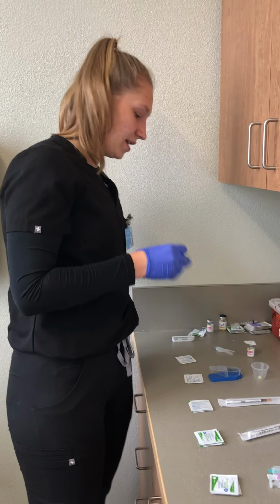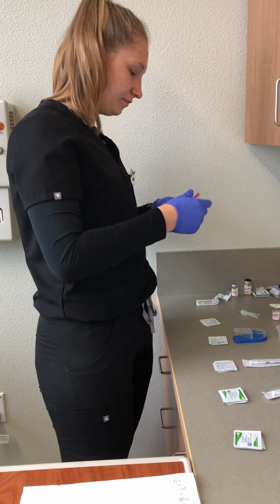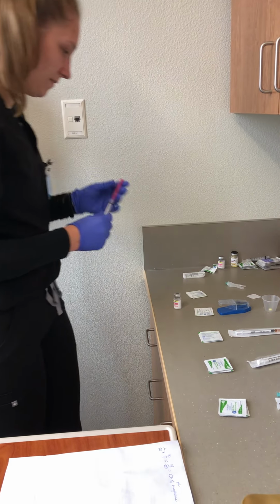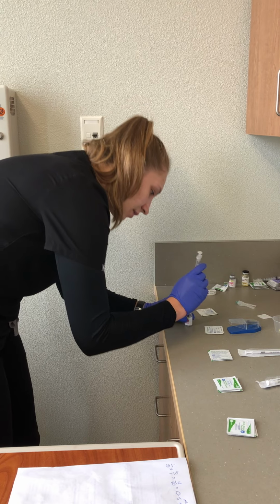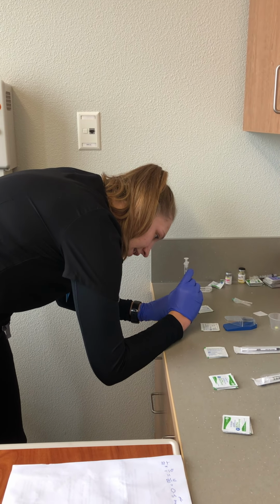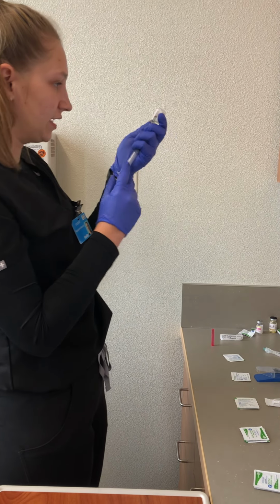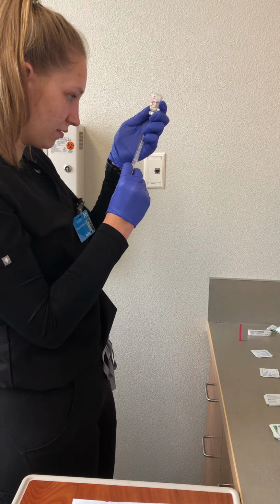I'm going to place it on my syringe. I'm going to take this right here, uncap it, and go ahead and stick it in. I'm going to draw up 0.5 milliliters of morphine.